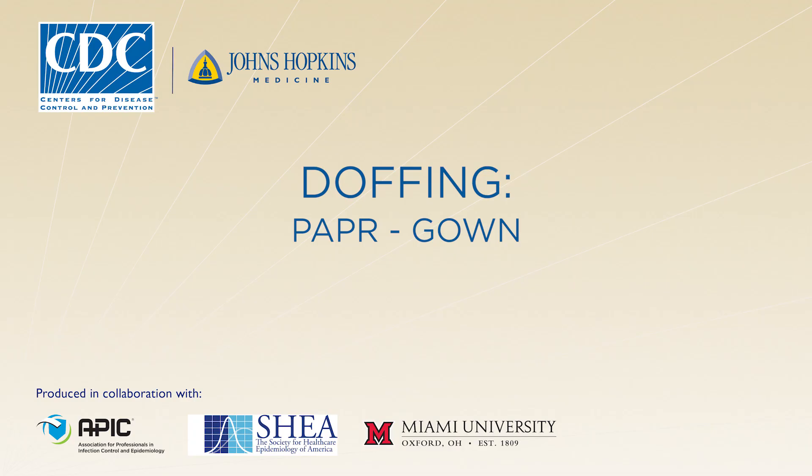In this video, you will learn how to doff or remove your personal protective equipment in accordance with CDC protocols. Following the doffing protocol will minimize the risk for disease transmission, so it's very important that you understand all of the steps.